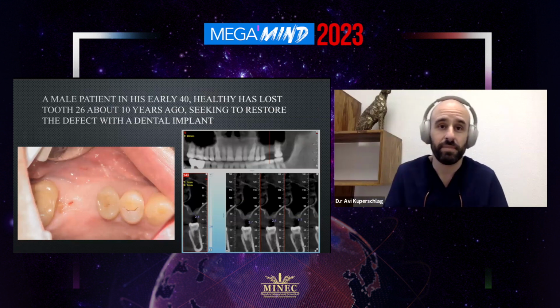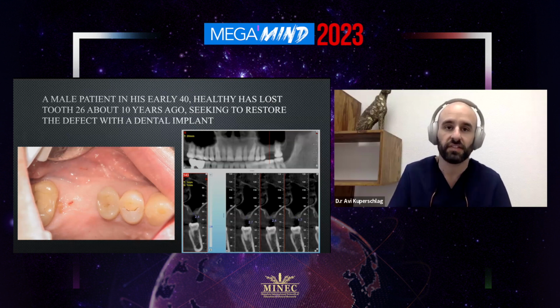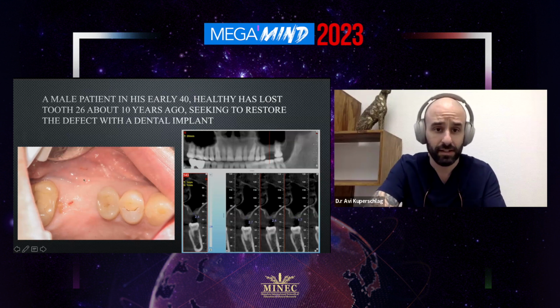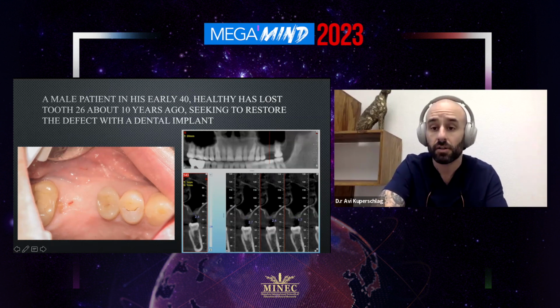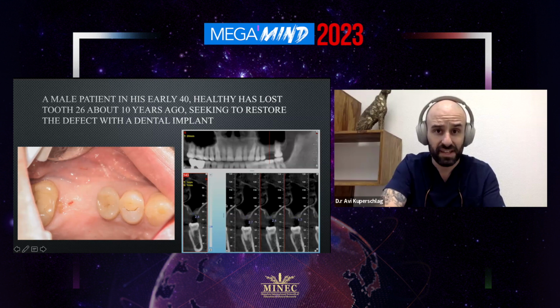So we have a male patient. He's in his early 40s. He's healthy. He lost his tooth 26 about 10 years ago. He wants to restore the defect with a dental implant. So we have the clinical view. We have a little bit of some root that was left here for I don't know how long. And this is the CBCT that I will talk about a little bit more seriously in 1 second.